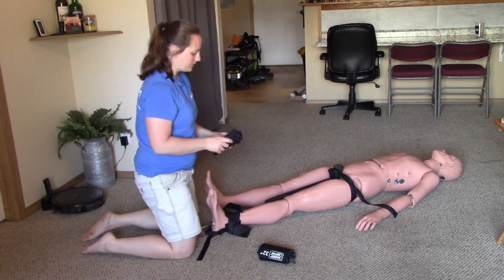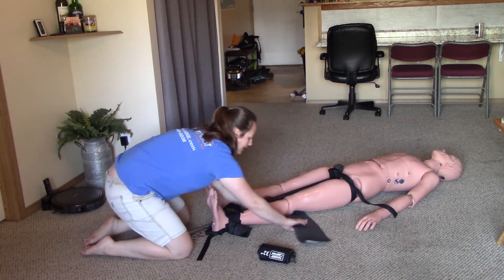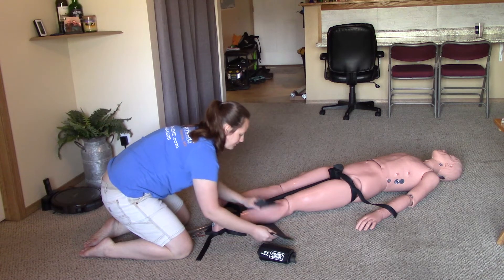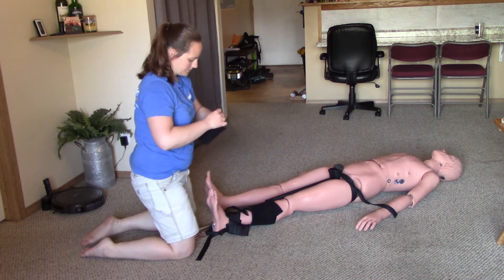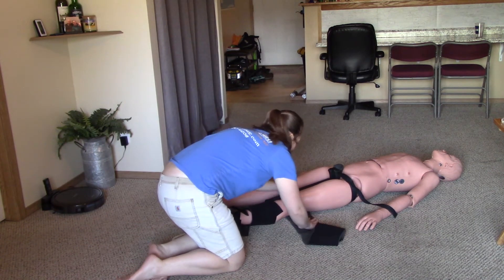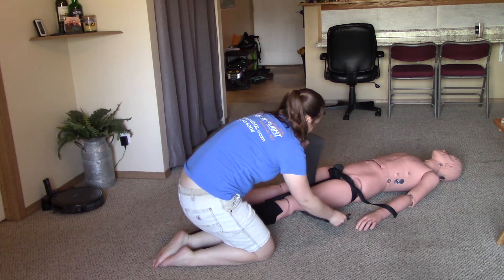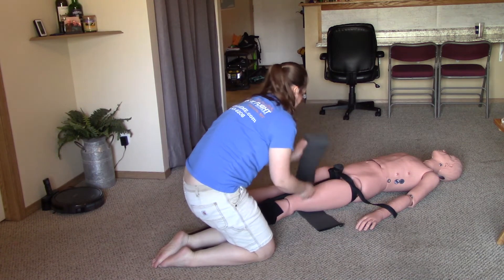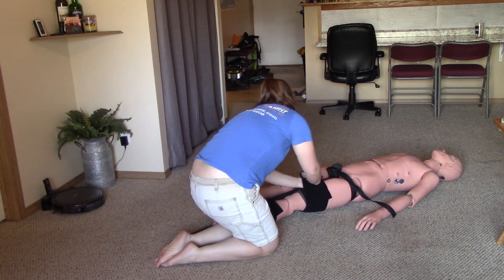I'm now ready to apply the securing straps. I'll take the 24-inch strap, which is the shorter one, shimmy it under the knee, and then see-saw it down to the lower leg. You don't ever want to put straps over the top of the knee — that gets very painful very quickly. Then I'll take the longer strap, slide it underneath the gap under the knee, and shimmy it up. This one can go right over the top of the injury because it's so soft and stretchy, and it'll actually help provide some compression. If the strap is a little long, fold it back under itself and stretch it over the injury.